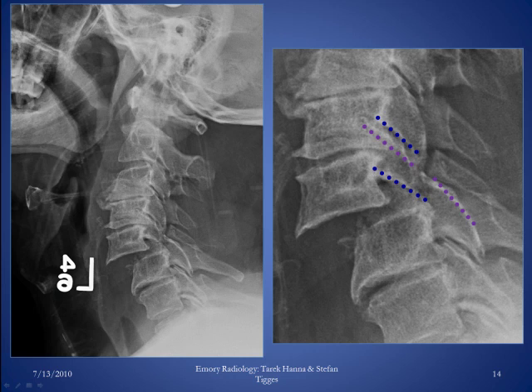Here is another example of bilateral facet dislocation in an older individual with significant degenerative changes and large anterior and posterior osteophytes. At C5-C6, you can see marked anterior displacement of the C5 vertebral body with respect to C6. Zooming in, the facet joints are dislocated at the C5-C6 level. For comparison, the normal C4-C5 facet articulation is shown above. The important thing is recognizing that alignment is not maintained, then interrogating the facet joints more closely to confirm they're dislocated bilaterally.